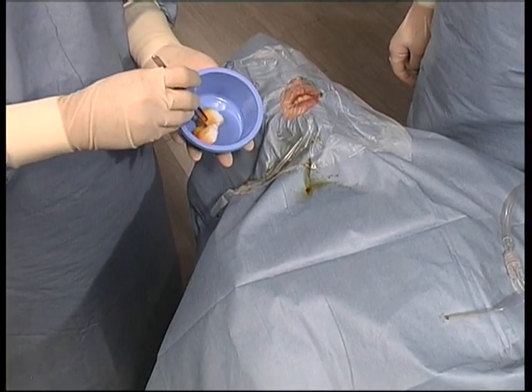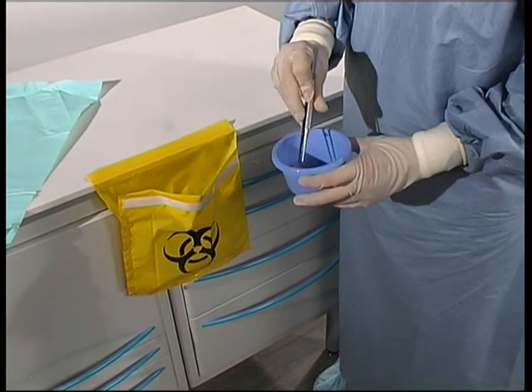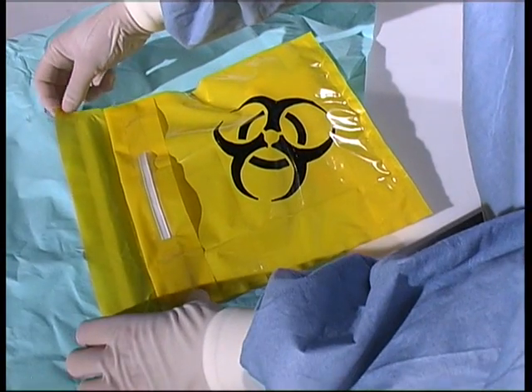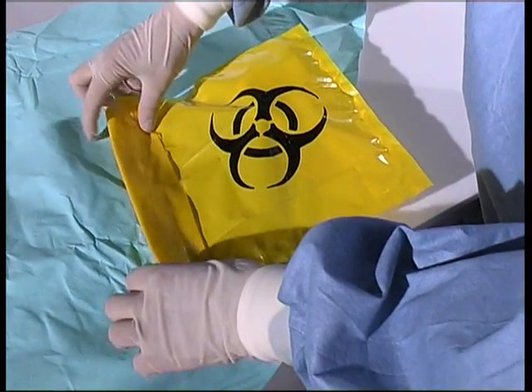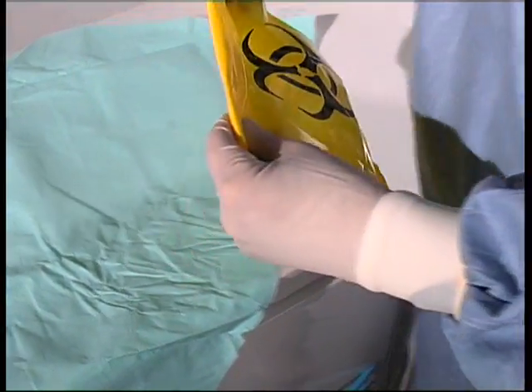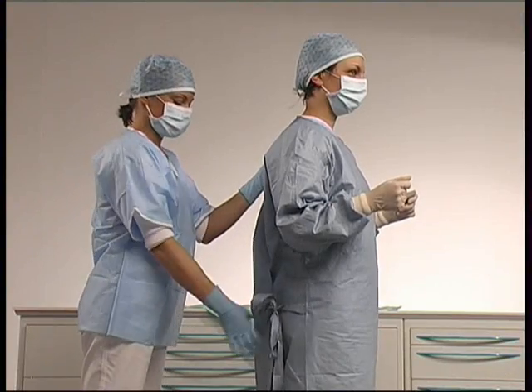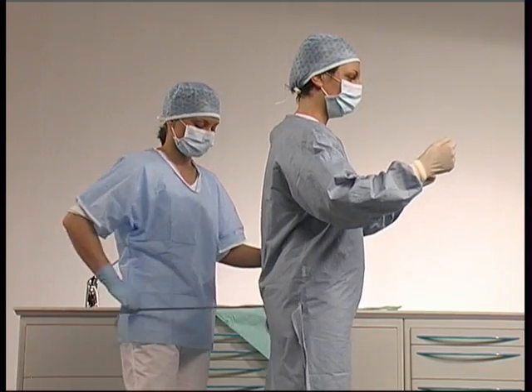Once the operation is over, the highly contaminated materials, such as gauze, pads, and filters, are sealed inside the specially marked pouch. The patient drape is folded up towards the inside to avoid staff contact with the contaminated side. The same procedure is used for undressing the operators.